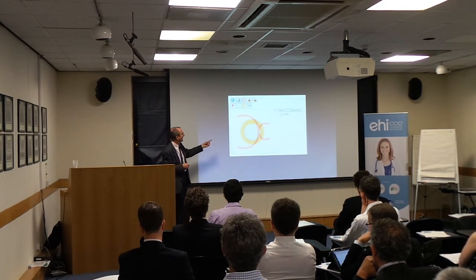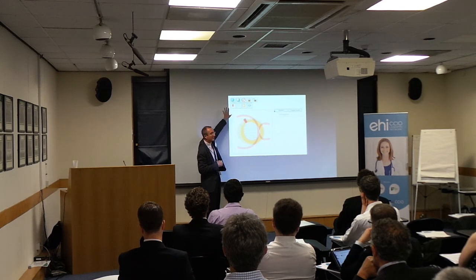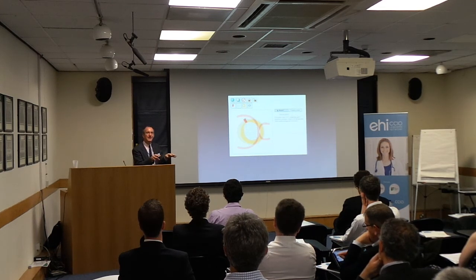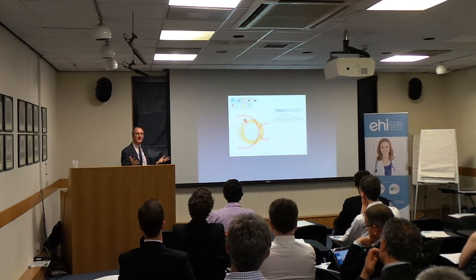And this is recording details about an optic nerve, which is damaged in glaucoma. That's why you lose peripheral vision. So this is doing a notch in the optic nerve where you've lost that amount of nerve fibre and you've got a corresponding field defect. The group then play around with that and then feedback by email saying that's absolute rubbish, or no, that's perfect, or usually somewhere in between.